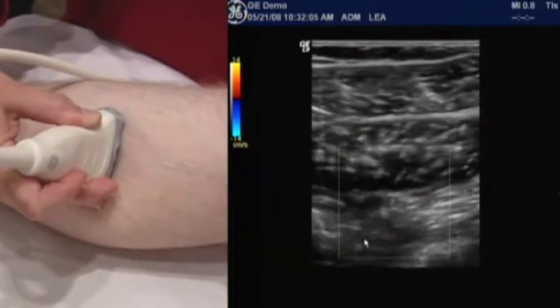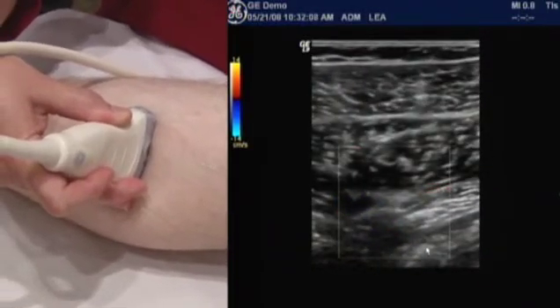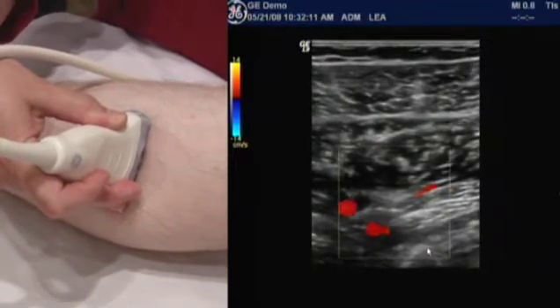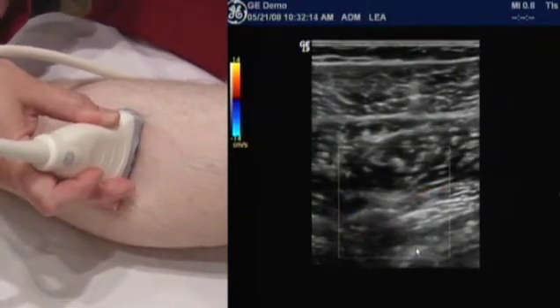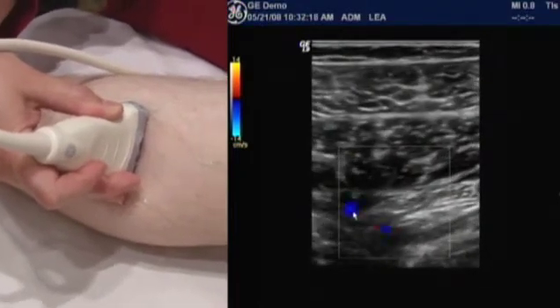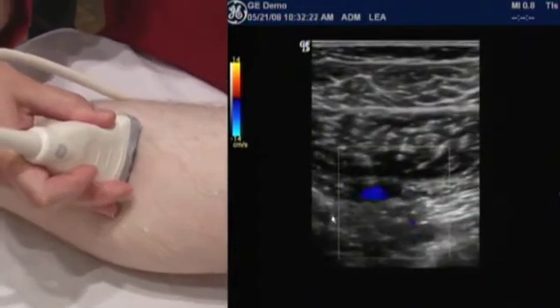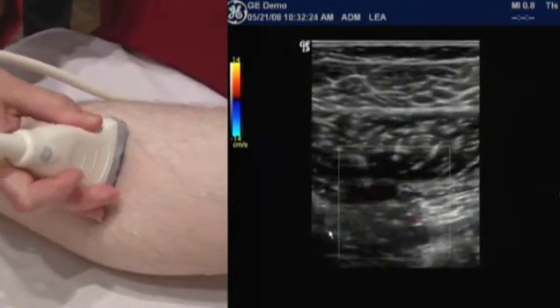And the peroneal artery is going to stay deep right on top of the fibula. This is the edge of his fibula right here. The peroneal vessels used to be called the fibular vessels, fibular artery, fibular vein, because of their orientation. This guy up here that's going to sit up a little higher and a little closer to the edge of the tibia is going to be the posterior tibial.